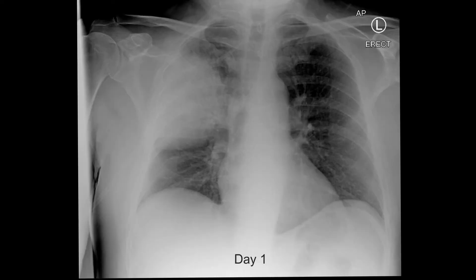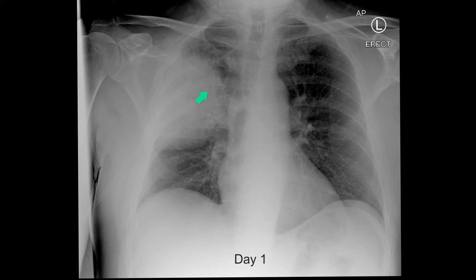The bulging fissure sign on chest radiograph and CT. Here is a patient who presents with a two-day history of pyrexia and cough, but not expectorating any sputum. He's very unwell, and you can see that the right upper zone contains a mass-like area of consolidation. You can just see some bronchograms running through it.